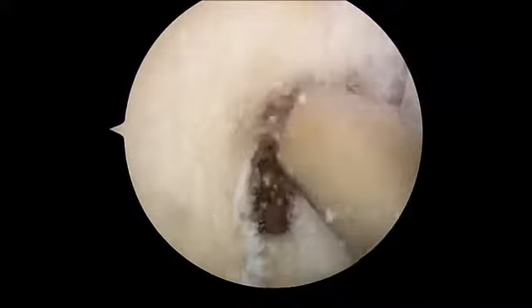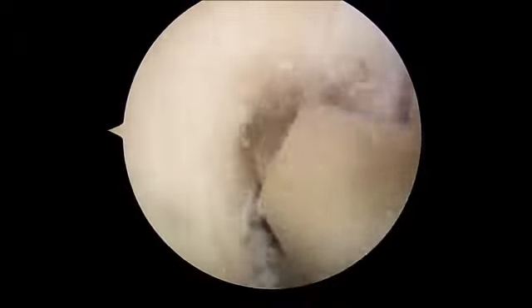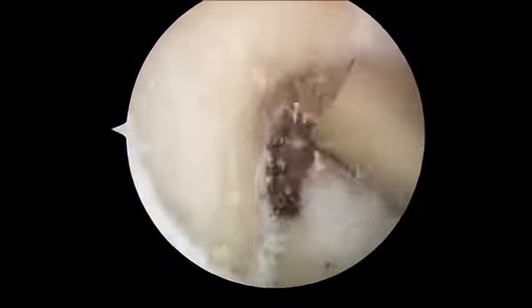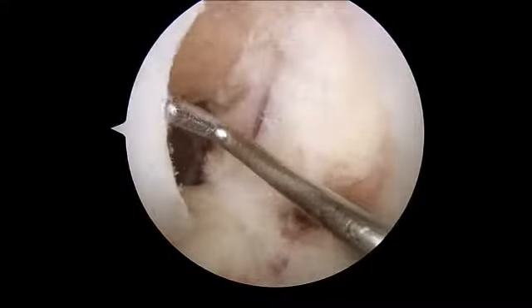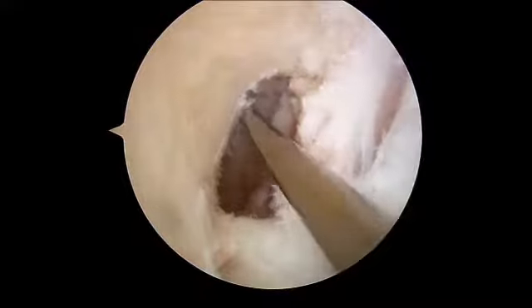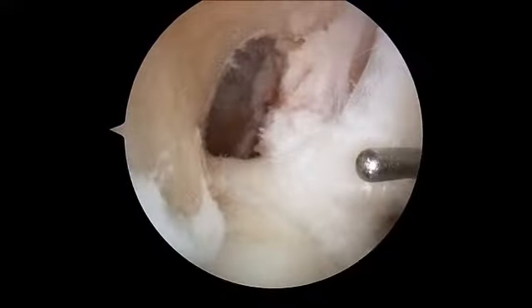Here we are with my 4.0 millimeter burr, and we're finishing the notchplasty. And again, it's very, very important to see all the way to the back of the knee, which is where the native ACL used to attach, so that we can put the new ACL exactly where it needs to go. So we have a nice wide notch, and I can see all the way to the back of the knee. And now we're ready to start our tunnels.